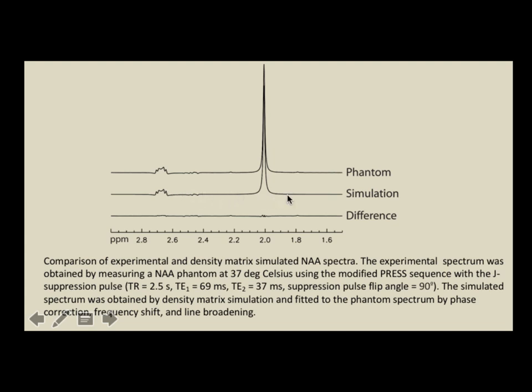Then this spectrum is obtained by density matrix simulation, then fitted to the spectrum. You see how well the fit is. All the details agree. I was surprised how accurate it is. So basically our simulation agrees with the experiment really well.